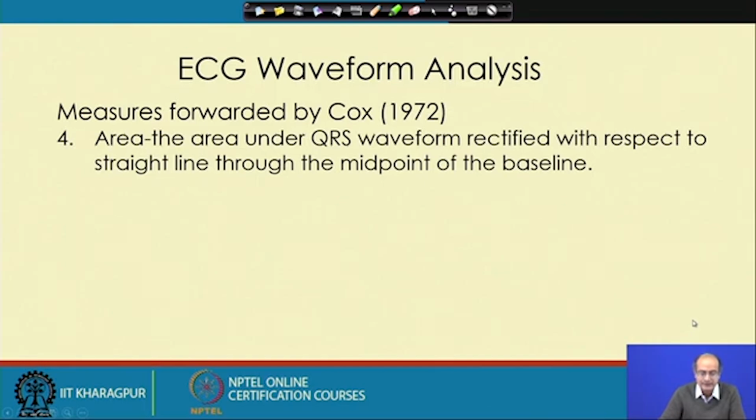Next is the area under the QRS waveform, rectified with respect to the straight line through the midpoint of the baseline.